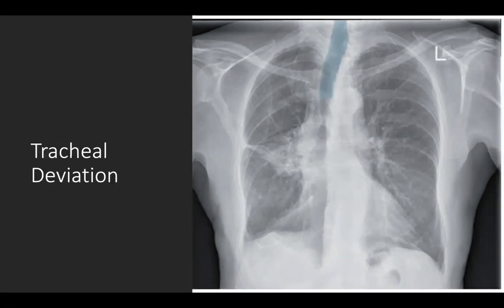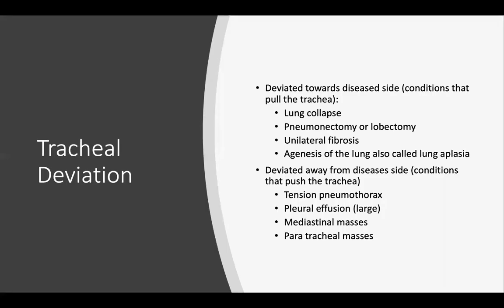This is an example of tracheal deviation. You can see the trachea highlighted in blue, showing right tracheal deviation. The trachea is considered deviated if any portion along its length is completely to the left or right of the midline. Make sure the film is not rotated, as a rotated film can give the impression of tracheal deviation when the trachea is actually midline.